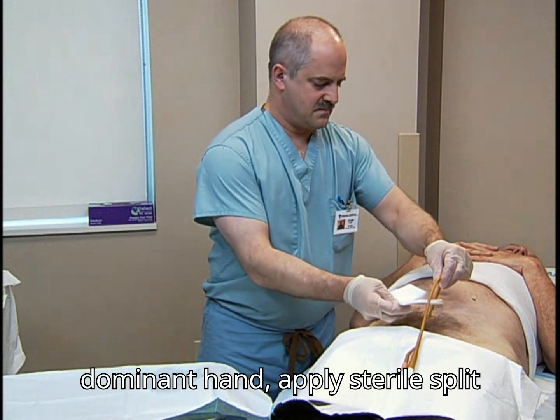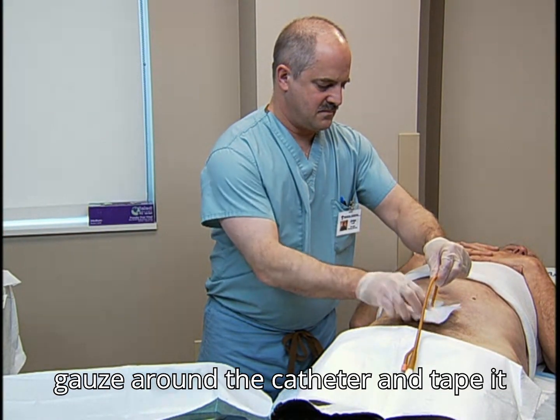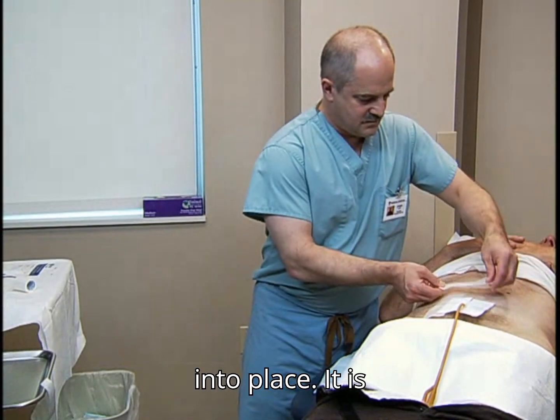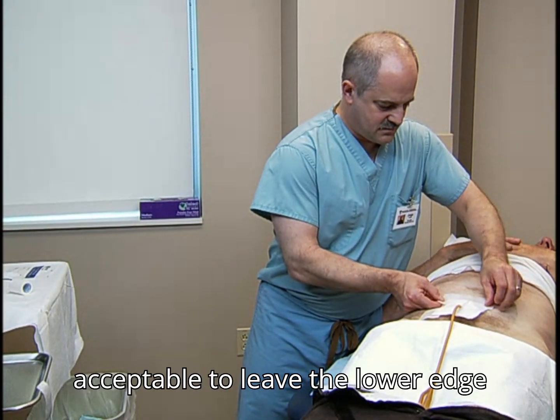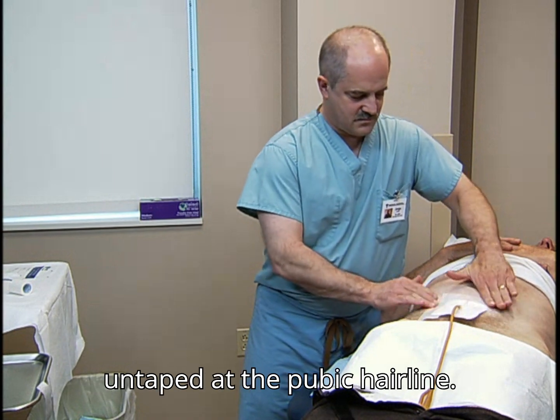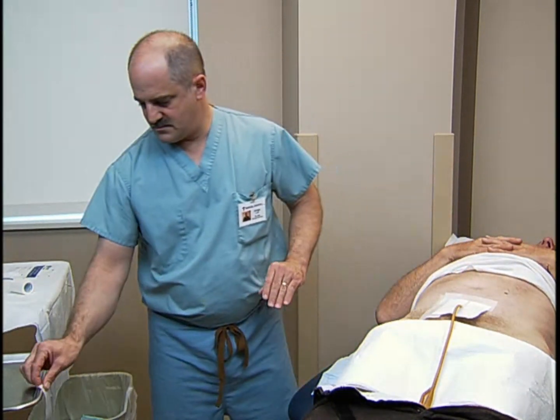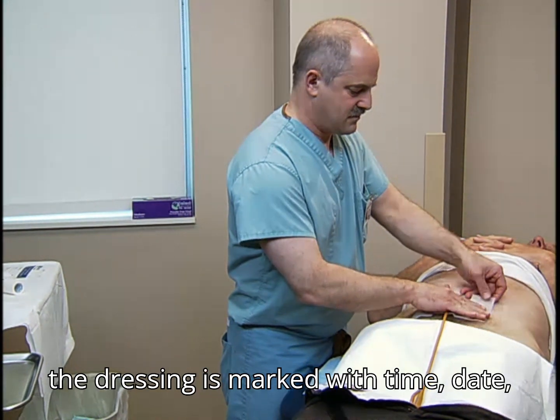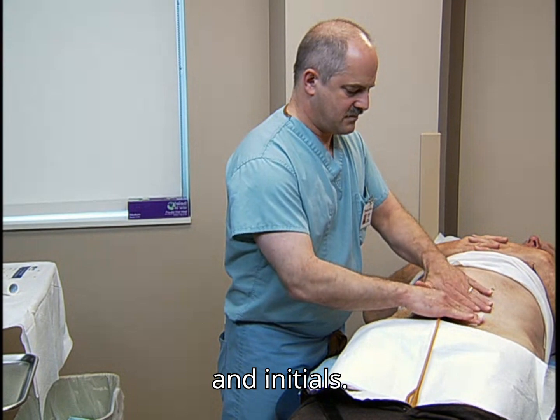With your dominant hand, apply sterile split gauze around the catheter and tape it into place. It is acceptable to leave the lower edge untaped at the pubic hairline. As with all dressing changes, make sure the dressing is marked with time, date, and initials.